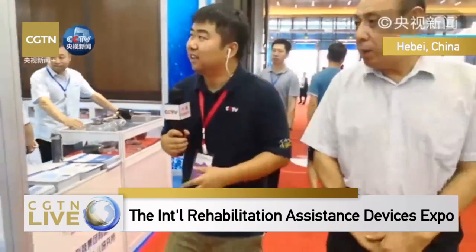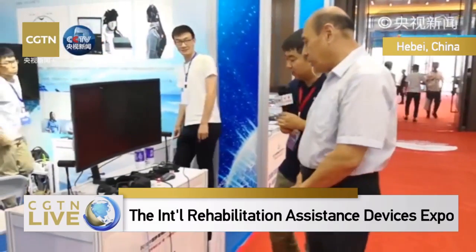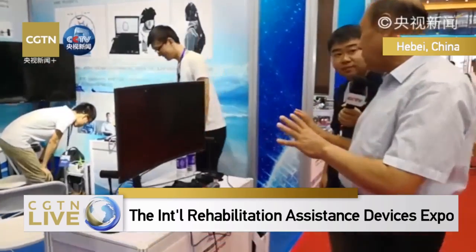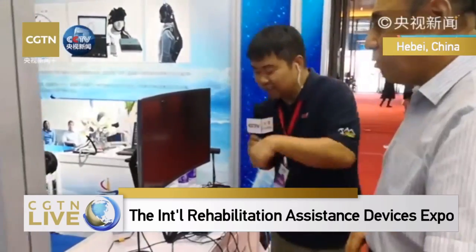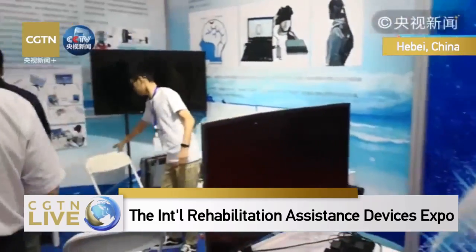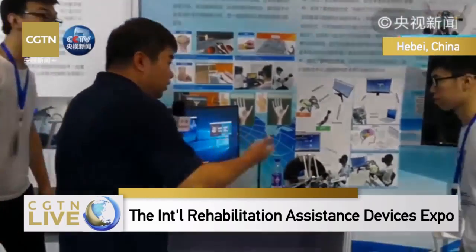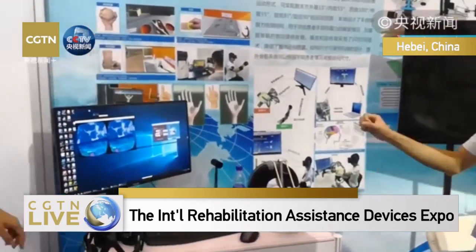This is actually only one of the manufacturers in this exhibition. Here you can see some lab products that are still under development in the universities. Let's have a look. Can you tell us what this system is for?